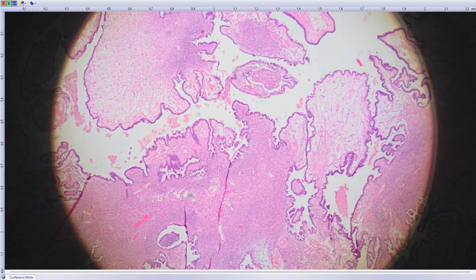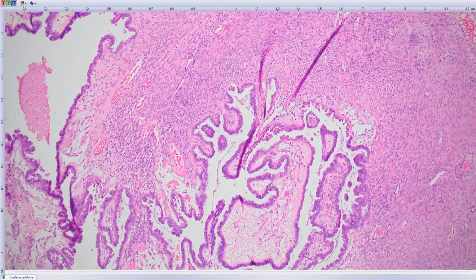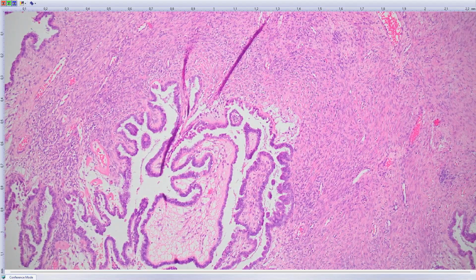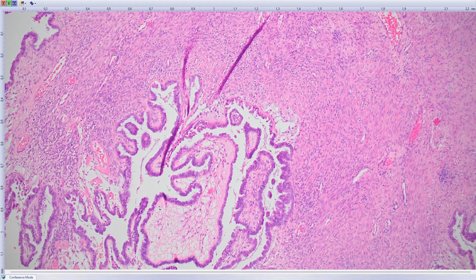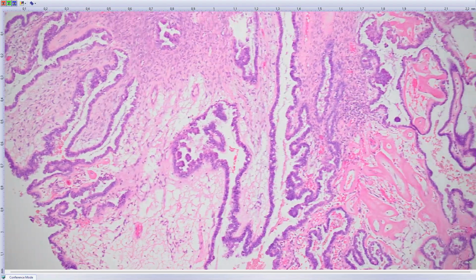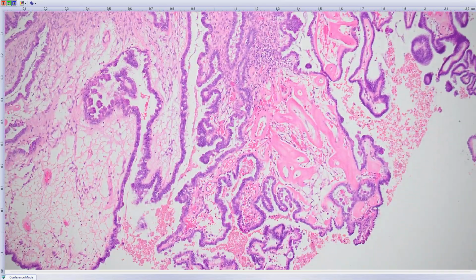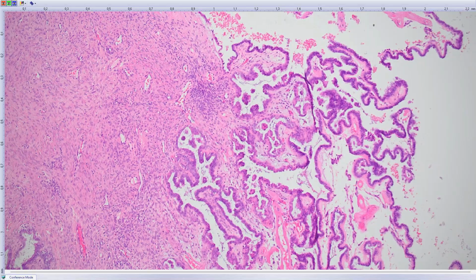These are quite rare lesions, and as I said, they originate from endometriosis and can transform into seromucinous borderline tumors. When adenocarcinoma arises from these lesions, it is endometrioid adenocarcinoma. The diagnosis of seromucinous carcinoma is not accepted, and when it is carcinoma, it has endometrioid phenotype.